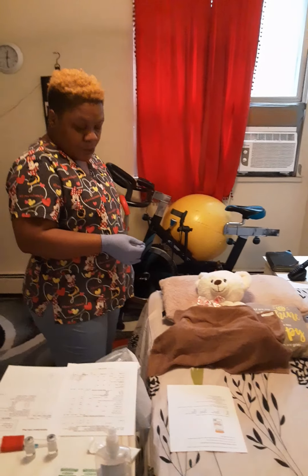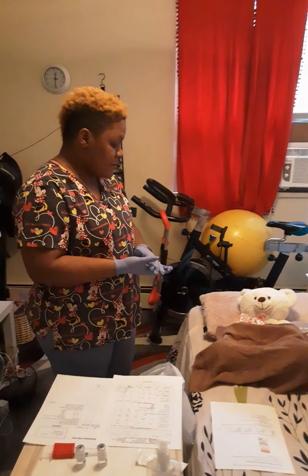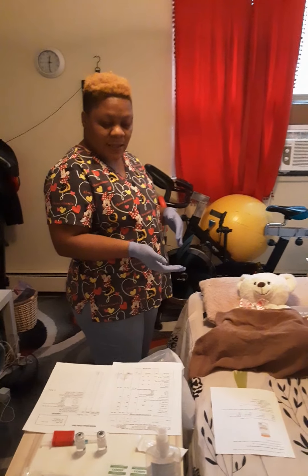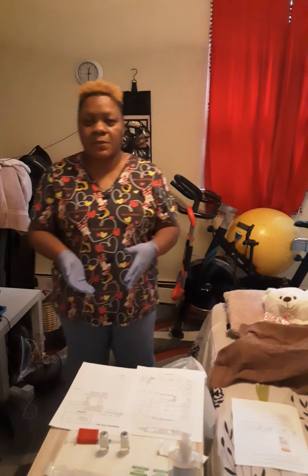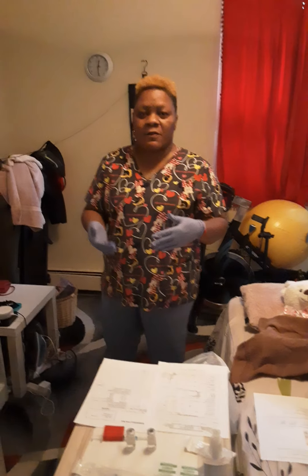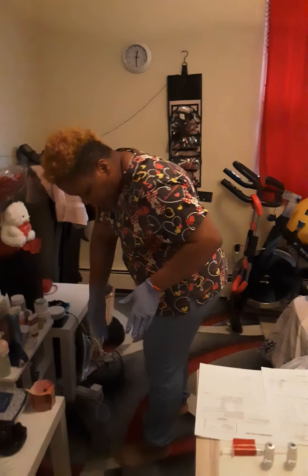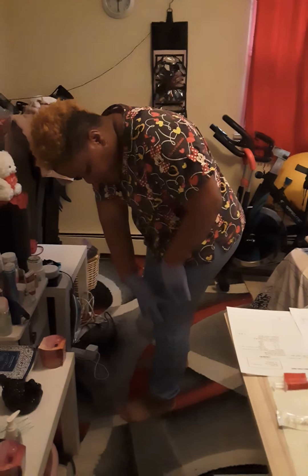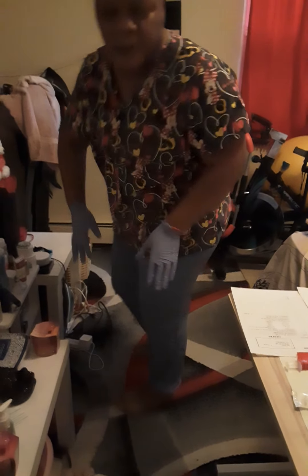The next thing I'm going to do is to ask the patient if he has any allergies. Do you have any allergies? No. Before I administer the medication I want to explain to you where the medication will be given. It will be given in the vastus lateralis. It is between the knee and the thigh area, separated into three parts, and it would be somewhere in the middle of the patient's leg.